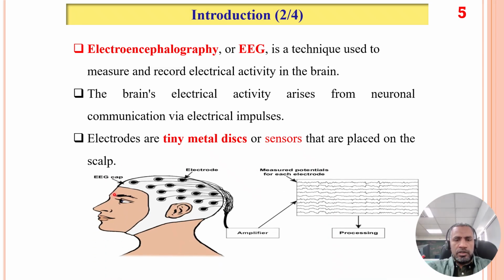In the figure, this is how the EEG is placed on our head. An EEG has at least 10 up to 20 electrodes around the scalp. Those electrodes are connected with tiny wires that lead to an amplifier. After amplification, it generates some sort of waves. That's how data is generated in the computer.